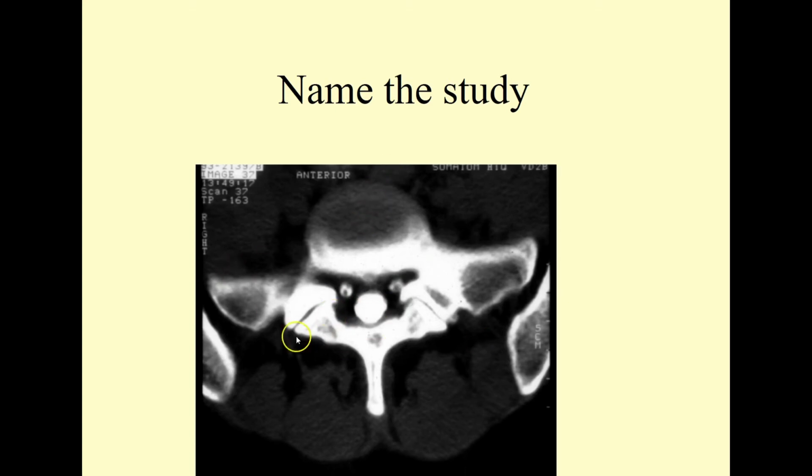So again, we'd like to know about the CT myelogram, why is it important? This is considered to be the most sensitive test for central canal stenosis, where sensitivity indicates the incidence of true positives.